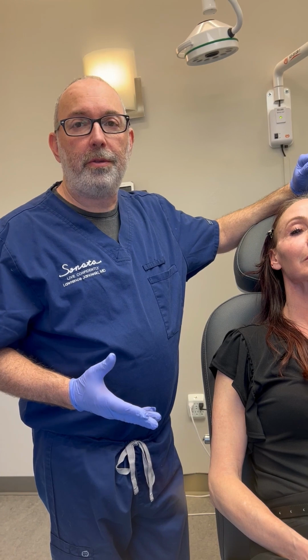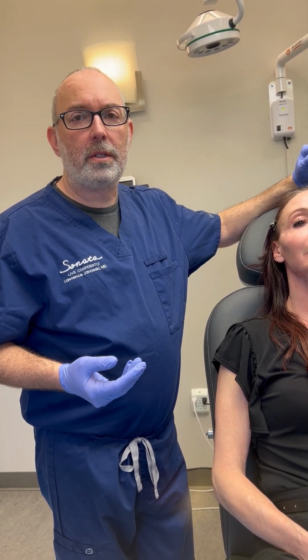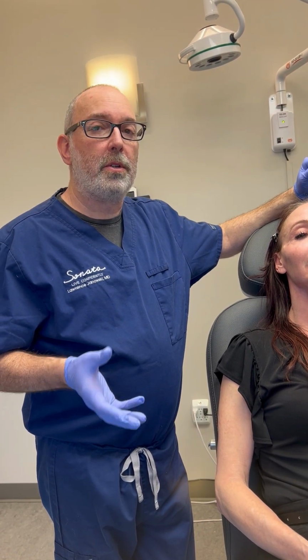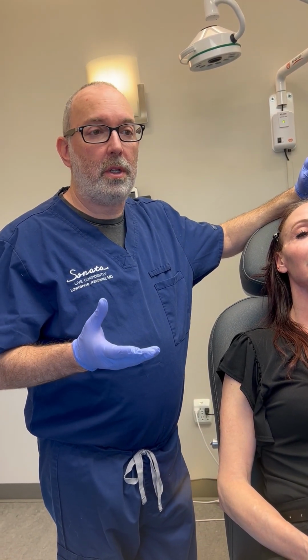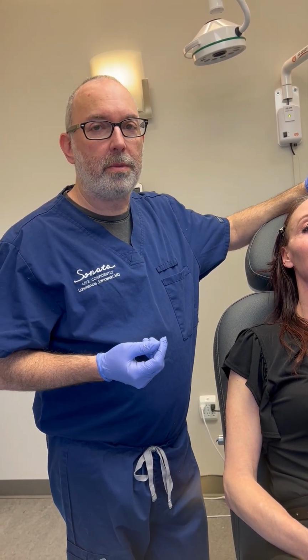We're going to do a number of fillers today. We're going to do Sculptra, and we're also going to use Restylane for the under eye, and Restylane Kiss for the lips. So you can combine these treatments into a single treatment. It's not a problem as long as they're not in the same areas as the Sculptra.